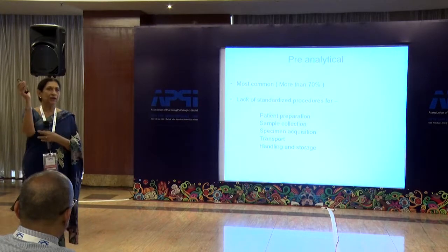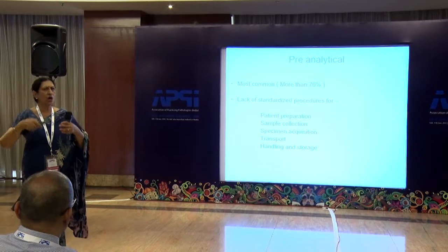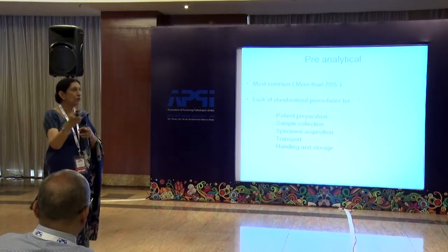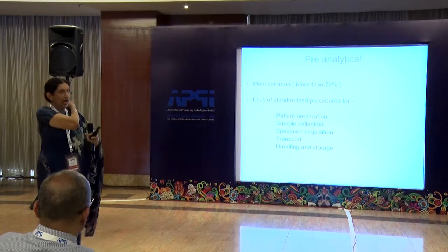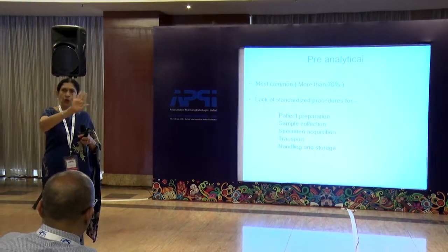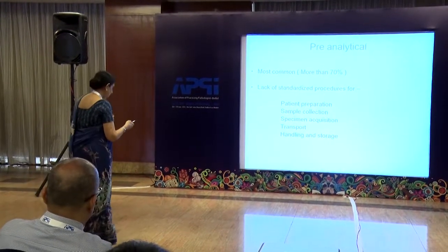I have had reports of factor 5, factor 8, 9, 11, all deficient. How can you have that? It is only because of poor transportation, because you are outsourcing your coagulation tests. Either do it yourself with proper quality control or don't do it. It's better to take care of all these things.